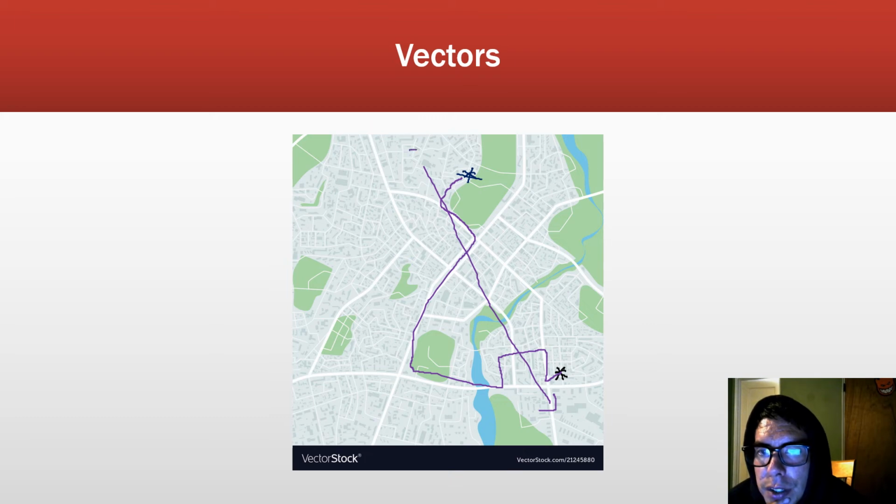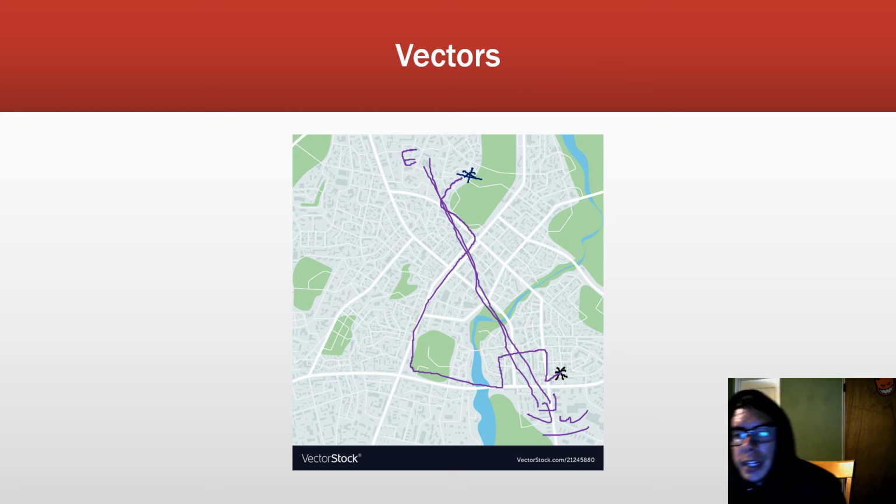We'll say this is east and west, so they'd have a westward vector. So this line, this arrow, is the vector, which is the overall direction they're going in. And that helps to not get confused by looking at all these little small changes they had. And that's how our heart works, because an EKG would mean nothing if we measured all the directions it went in, because it's flowing in all different directions as it spreads, so that would be useless to us. So instead, EKGs interpret it and show us the vector, so the overall direction it's flowing in.